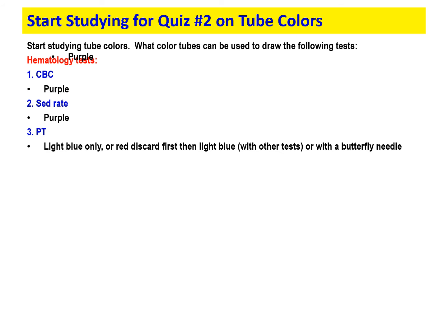And remember, anytime you're doing phlebotomy, and you know that you're going to have to draw a light blue top tube, which we know that our light blue top tubes are used for our coagulation studies, such as PTs, PTTs, factor assays. These tubes have an additive in them as well. It is also an anticoagulant, which is sodium citrate.